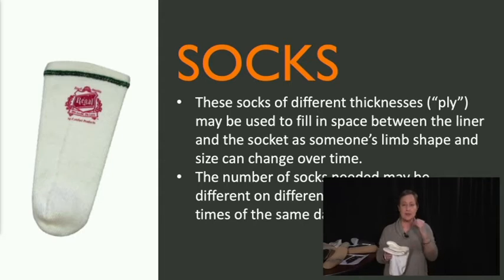So using some of your therapy sessions to work on this, I think, is really important. And you'll note too on the slide that the number of socks needed might vary with the time of day, right? In the morning they need fewer, by the afternoon they need more socks, and then over time the shape and volume of their limb will stabilize. That takes a little bit of time to happen.